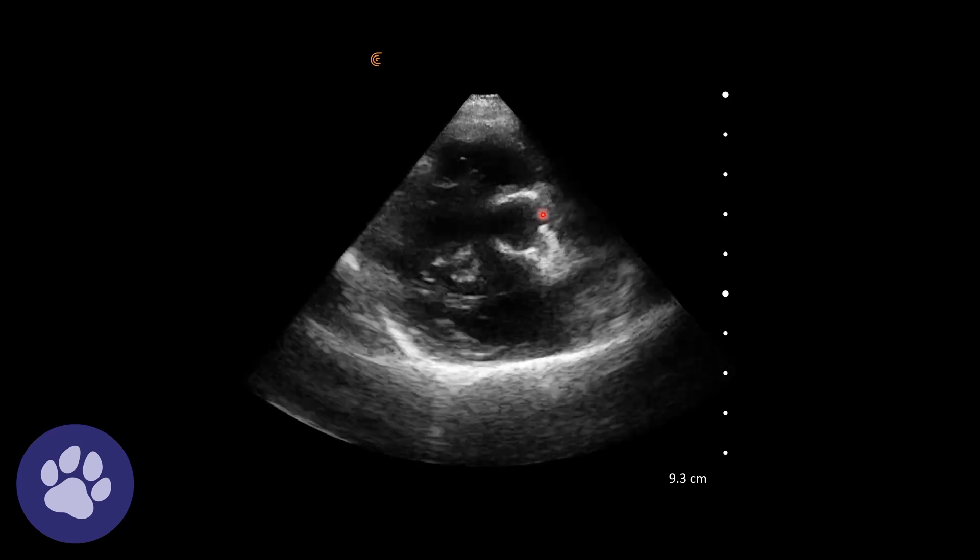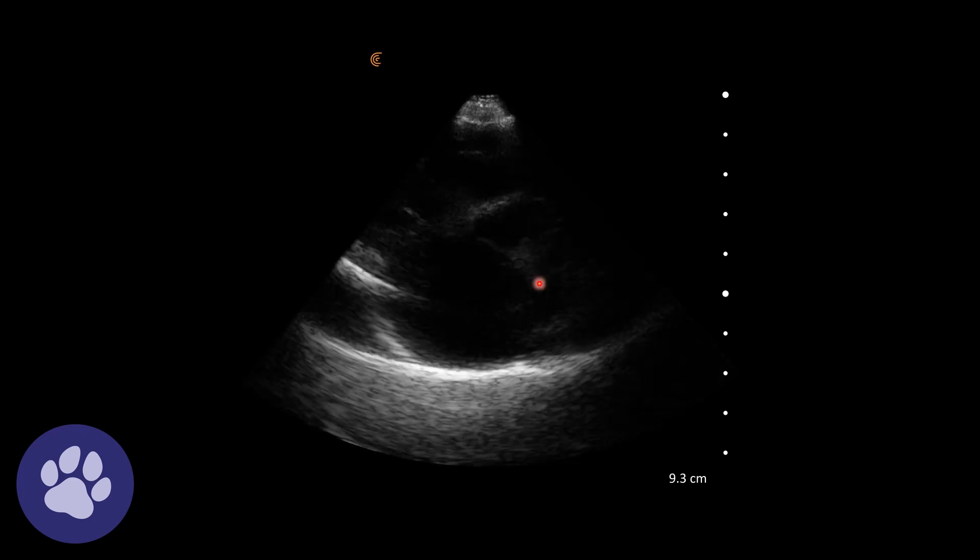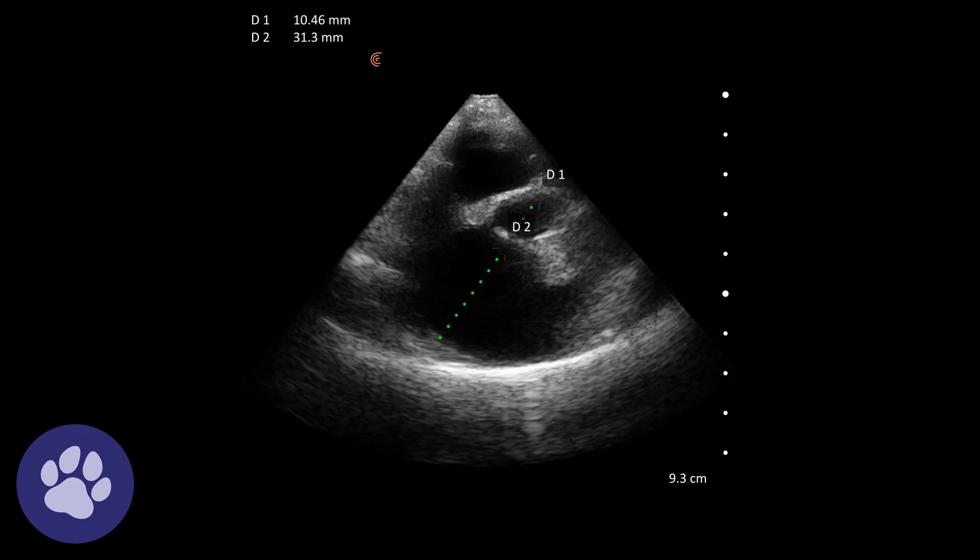We really want to assess how many aortas we can fit in the width of the aorta here. Taking a measurement and seeing how many aortas we can fit across the left atrium, it turns out we can fit nearly three — it should be less than 1.6. So this is clearly an enlarged left atrium.